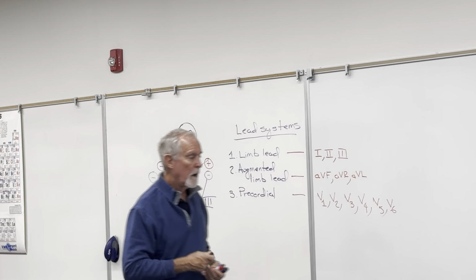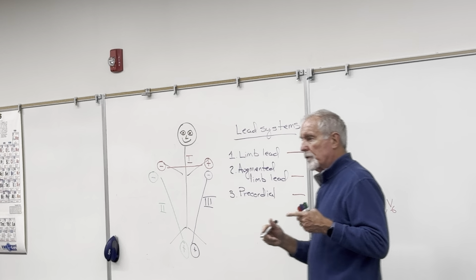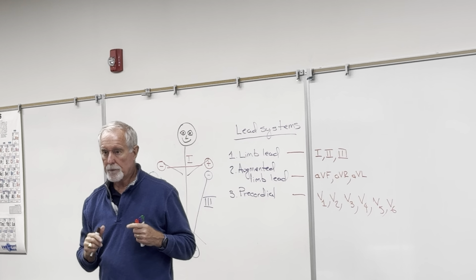So, there's what's known as vector cardiography. What you're seeing in those traces is really the representation of vectors.